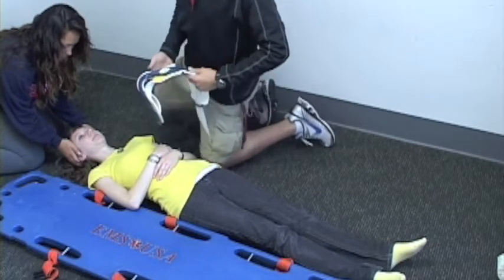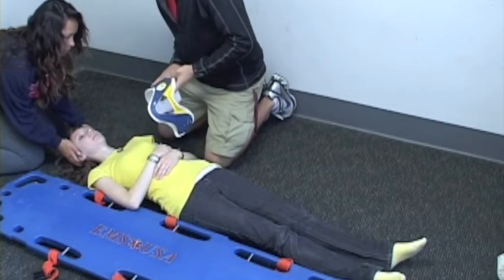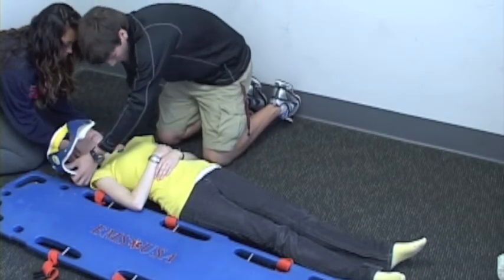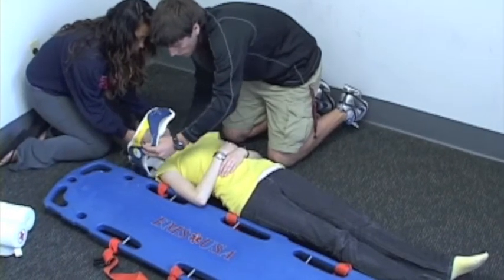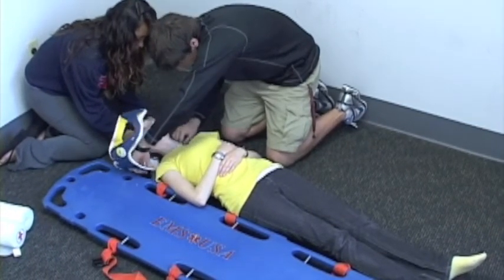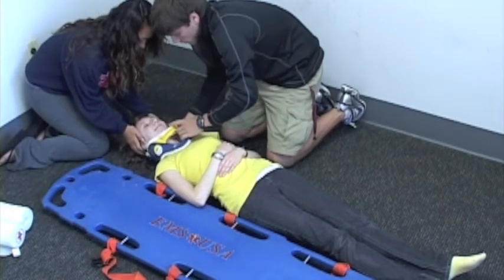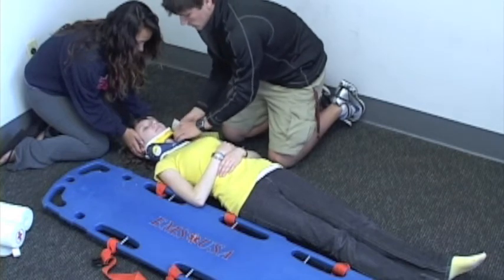The first thing I'm going to do is measure my C-collar to make sure it fits my patient. I'm going to use my fingers to make sure it is the proper height for my patient. Ma'am, I'm going to slide this behind your neck. I'm going to secure this right there.